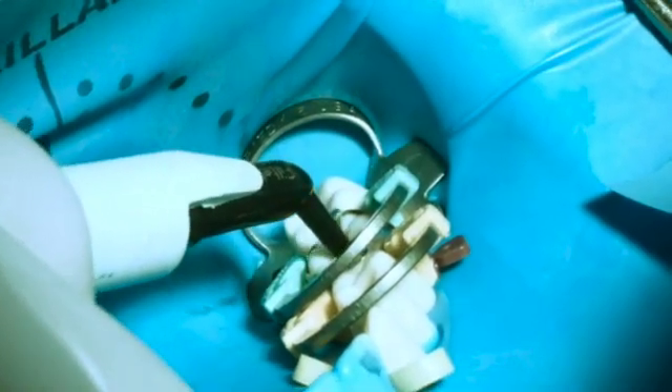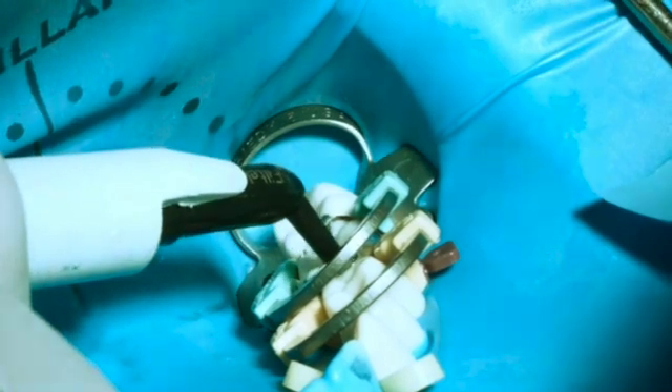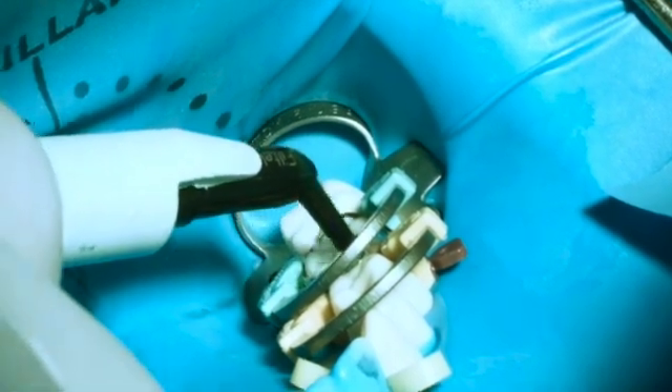I'm going to use the PPS instrument — the posterior packer and sculptor. It has a 0.8 millimeter end on one side and a 1.5 on the other side. What I'm doing here is pushing that band, making sure there's no flowable or anything where I don't want it. Now I'm ready to pack my paste — this is a bulk fill material, good for 5 millimeters.